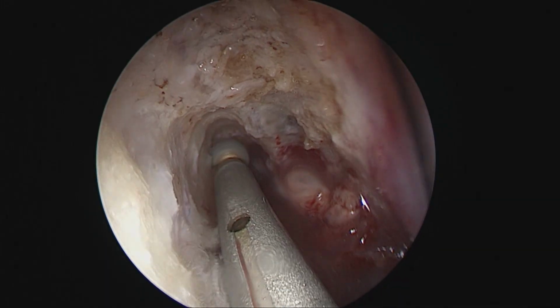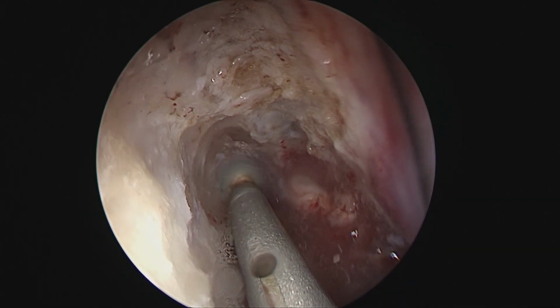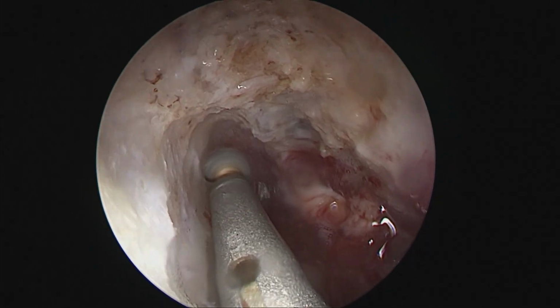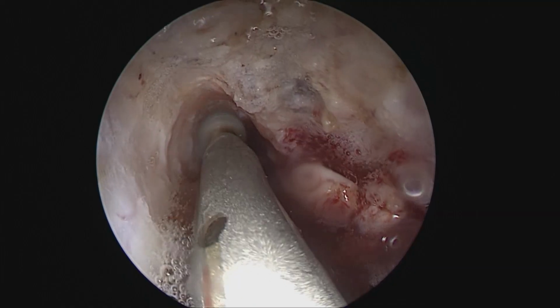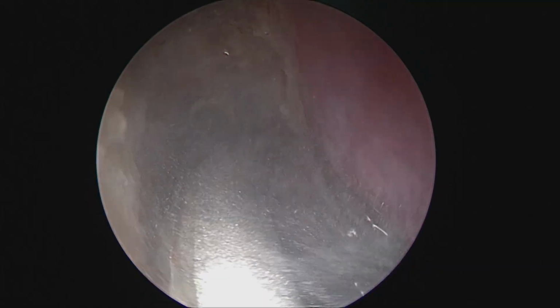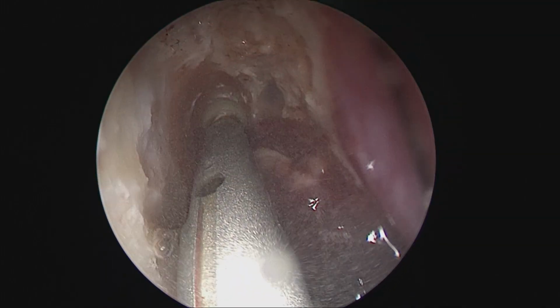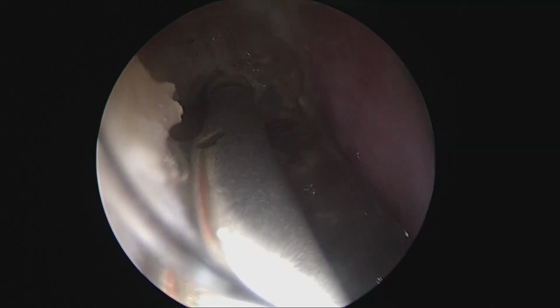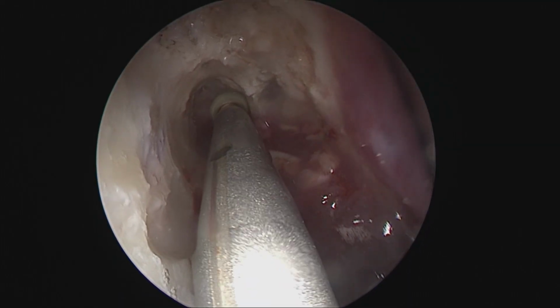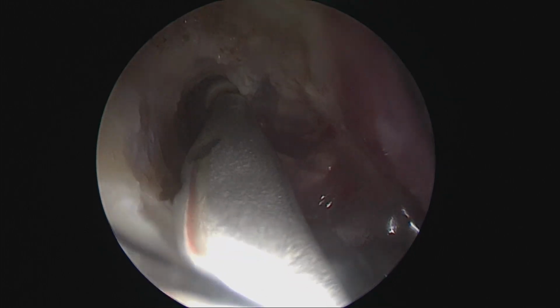We would move around the other boundaries, which are essentially the medial and the posterior ones. The lateral being lamina papyracea, which anteriorly we have exposed during the drilling process. So one needs to be patient in this part of the surgery and not drill randomly here and there, because that would get most people astray, and you would lose a sense of landmarks and perspective. So we are still taking our time to create the anterior boundary of our resection.